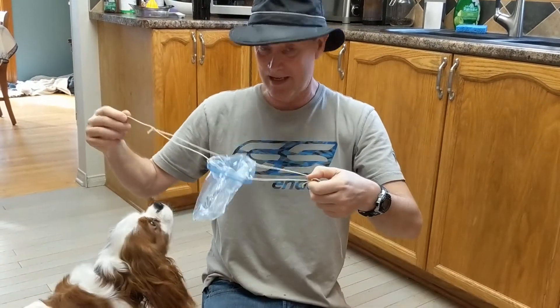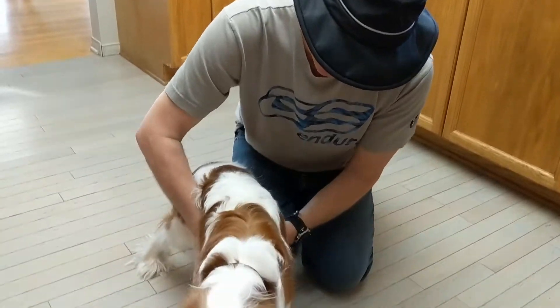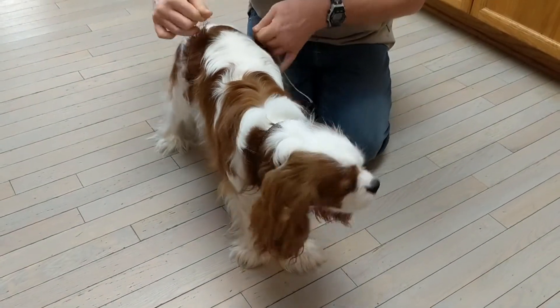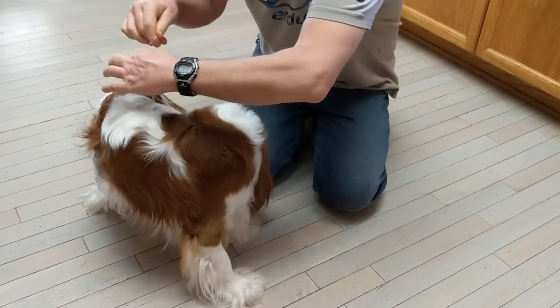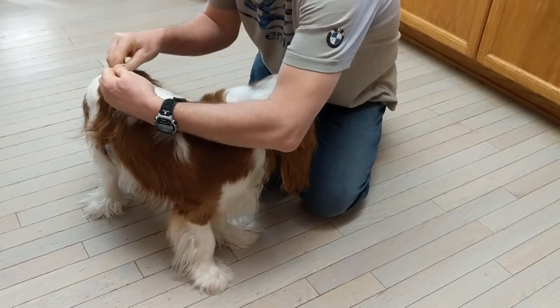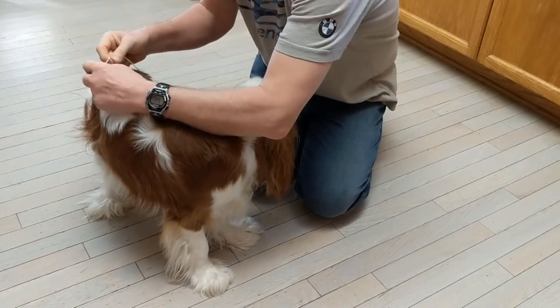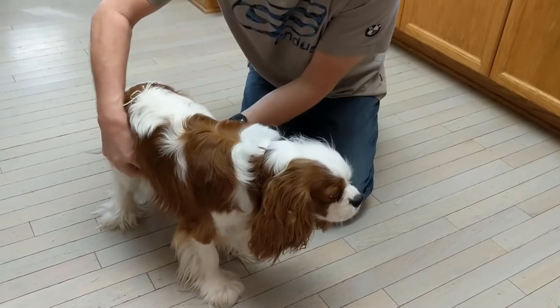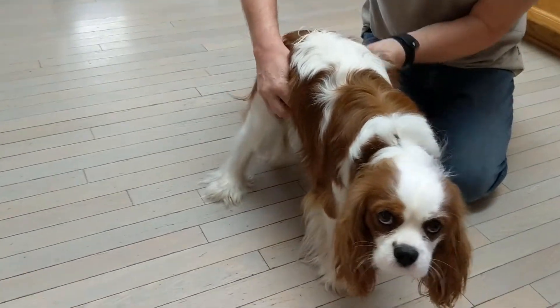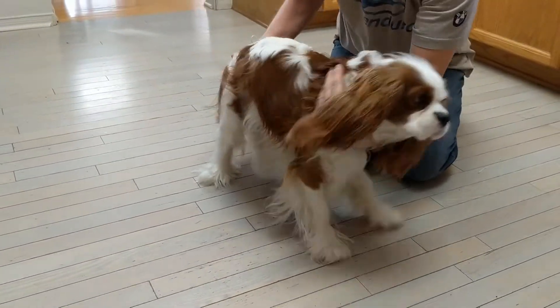So what we're going to do — and he likes it — is basically put this under him with his penis in it, and we're going to pull it up and tie a bow, not a knot, because we want it easy to remove. Now we just make sure it's positioned under his penis, like that.